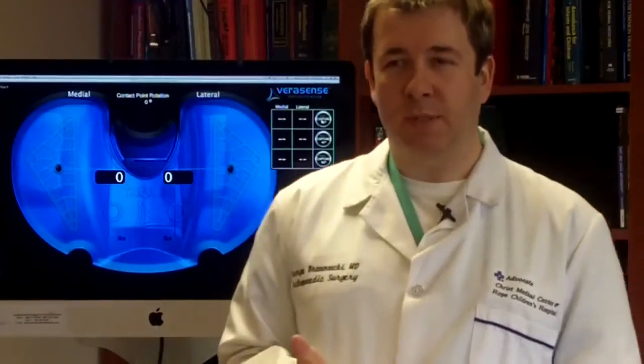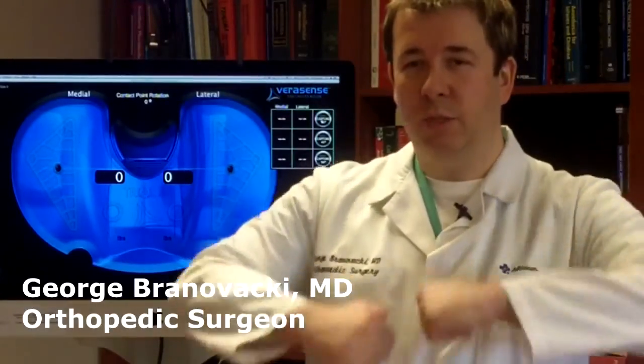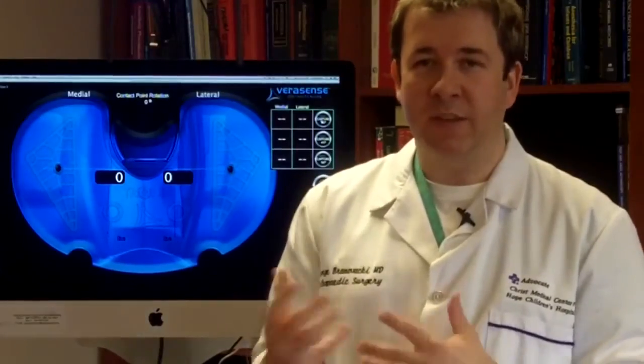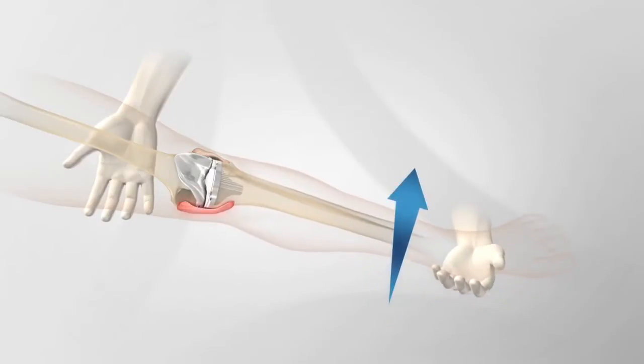Part of the art of doing a knee replacement is to put the knee in with the proper balancing. And so you want to have the extension, which is the knee straight, and the flexion at the proper positions with the proper tension. In traditional knee replacements, it's a kind of a feel that surgeons have. Does it feel too tight, too loose? Every surgeon has different preferences as to how to put their knee in.